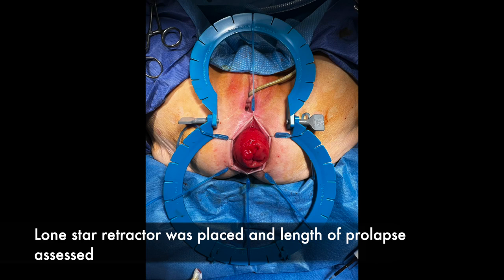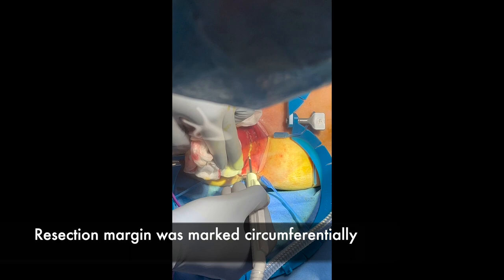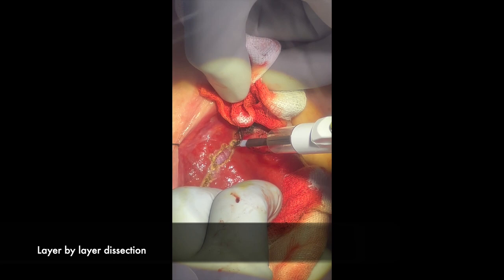Bilateral pudendal nerve blocks were administered, a Lone Star retractor was placed and the full length of the prolapse was assessed. The resection margin was scored circumferentially, just proximal to the dentate line. This dissection is carefully carried out circumferentially.